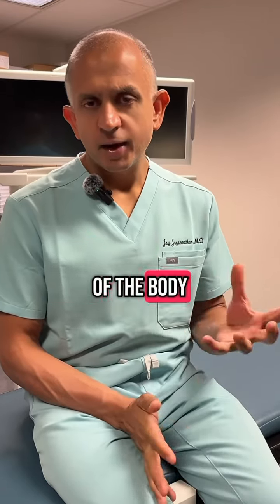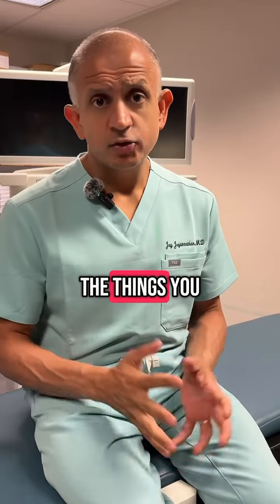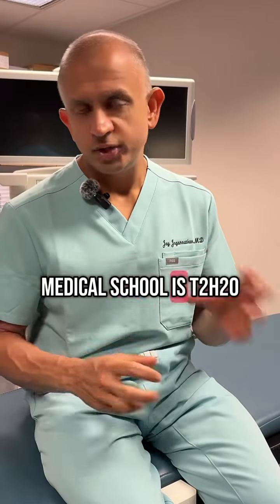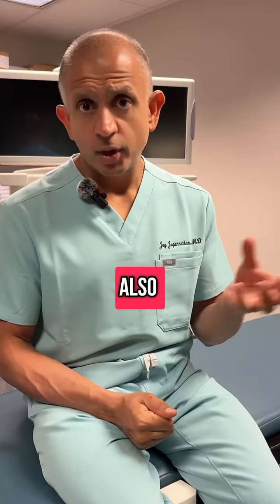So areas of the body that have more fluids, such as cerebrospinal fluid, tend to have different characteristics. And one of the things you tend to see, for example, on T2 weighted images, which is a specific type of image in MRI, is that water lights up. The mnemonic we learned in medical school is T2H2O. So anything with fluid in it tends to light up. Fat, for example, also responds differently.